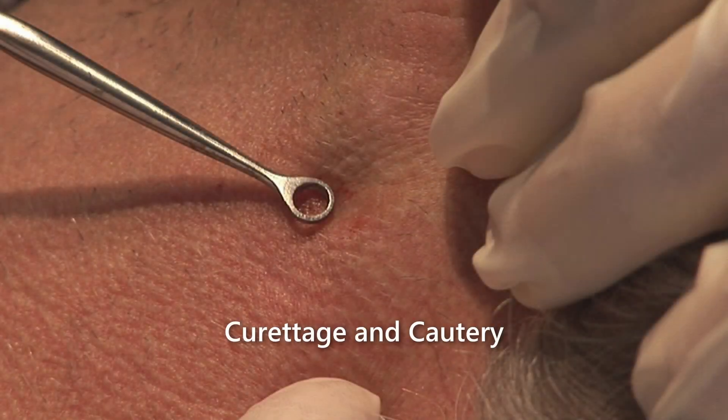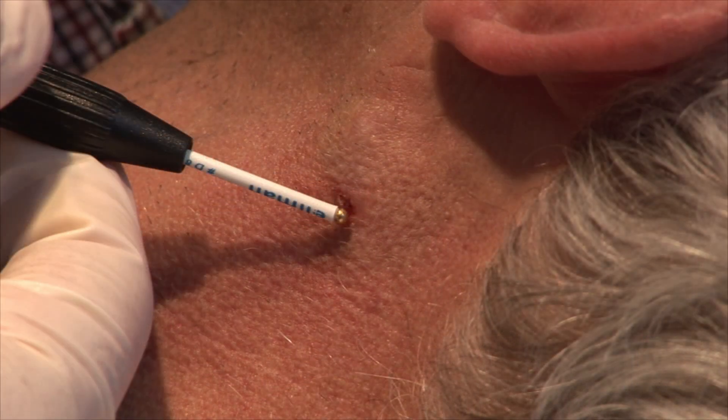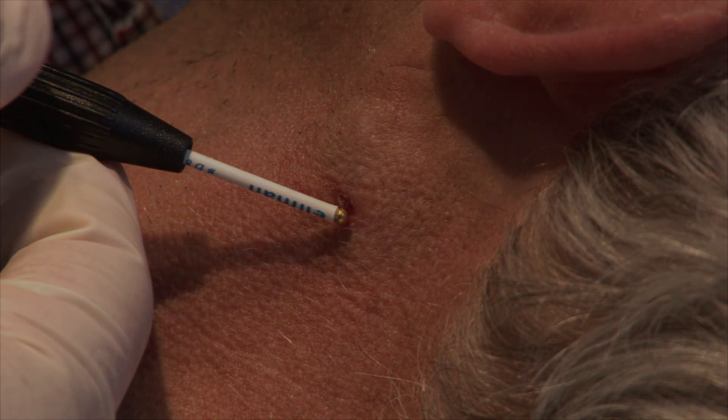Curettage and cautery is an effective technique for eradicating superficial basal cell carcinomas or benign superficial lesions such as molluscum contagiosum. This procedure should not be done for lesions that have advanced through the dermis.